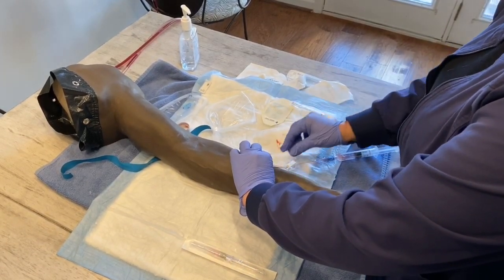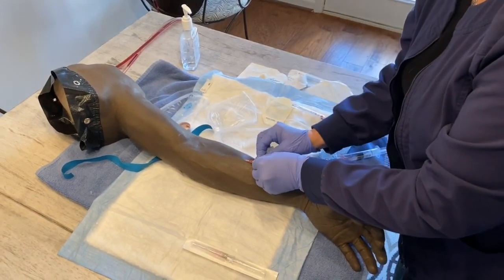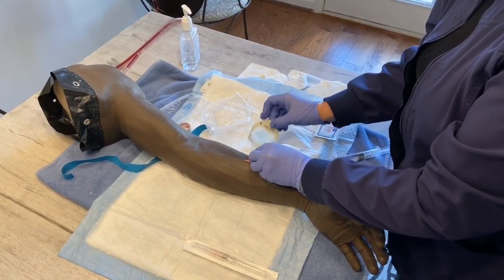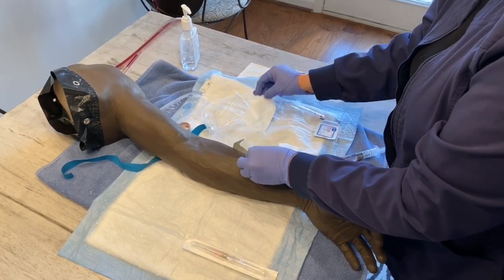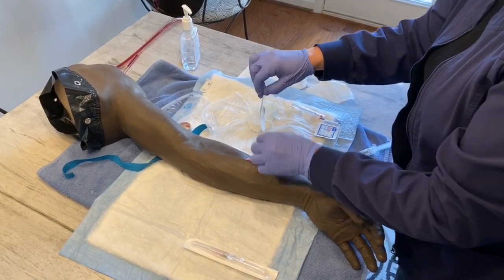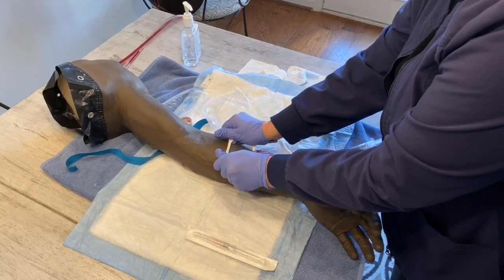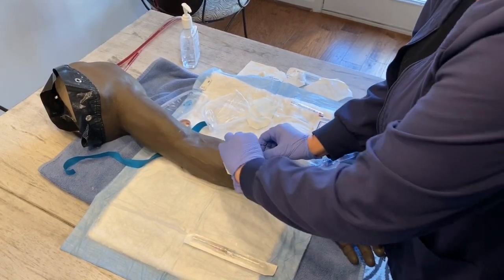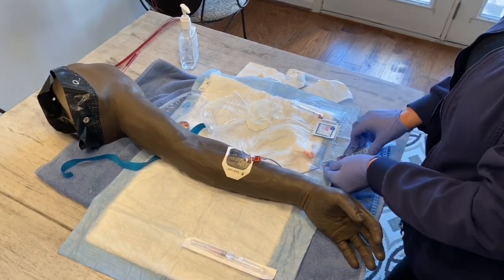Now it's time to secure the actual IV. I'm going to take the gauze that was in the kit and just clean up the blood around the site so that I don't have a wet area that can actually set up for an infectious site. I'm going to now take my Tegaderm. I peel it off. And this is good to sit as long as the patient doesn't move. I always like to say be very still while I apply this. I go over the site, making sure I am not covering where the extension is connected. Now that this is secure, I can release my hands and feel pretty comfortable.